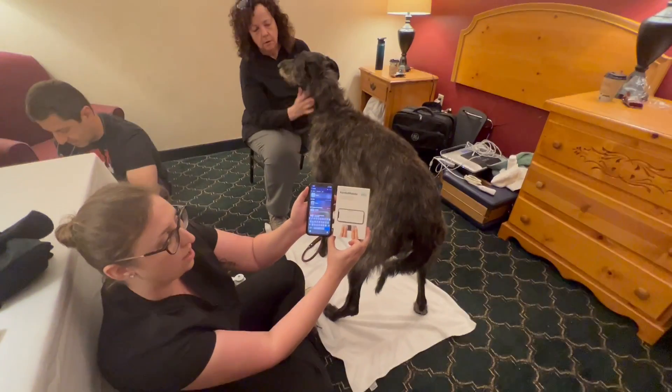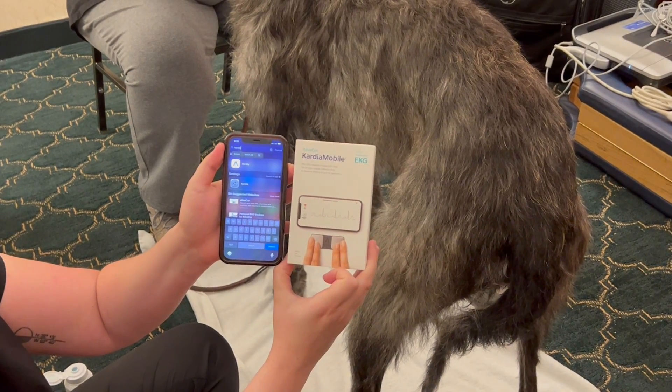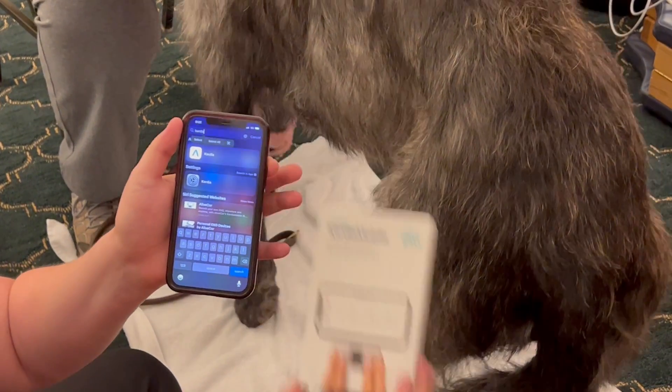The first demo is for the AliveCore Kardia Mobile EKG. This is going to use your smartphone application called Kardia — spelled K-A-R-D-I-A. You can search it in the app store and it's free to download.